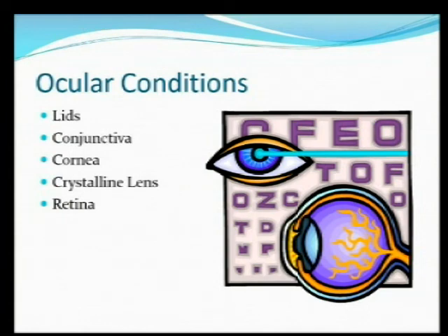In some cases, we will find that because of the condition, they would clearly benefit from wearing a contact lens. In some cases, it's to protect the eye, to relieve sensation, provide the best vision, variety of reasons. But in those categories, it would be an indication for contact lens wear. And then the third category will be what we would refer to as unremarkable. You look at it, the eye looks weird, but the condition has no impact on somebody's ability to wear a contact lens.